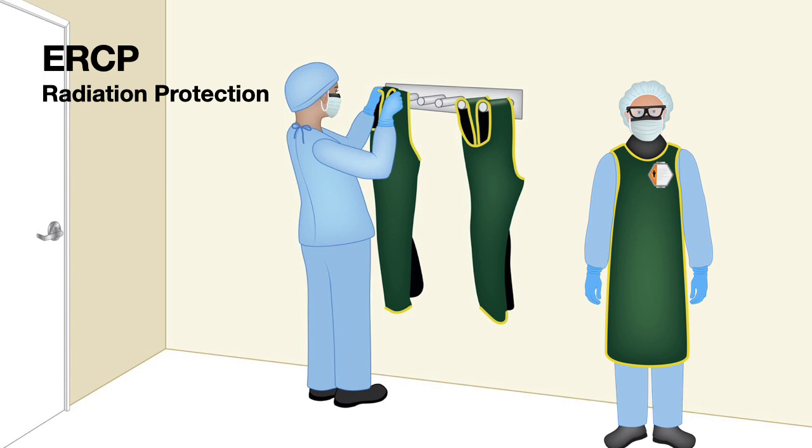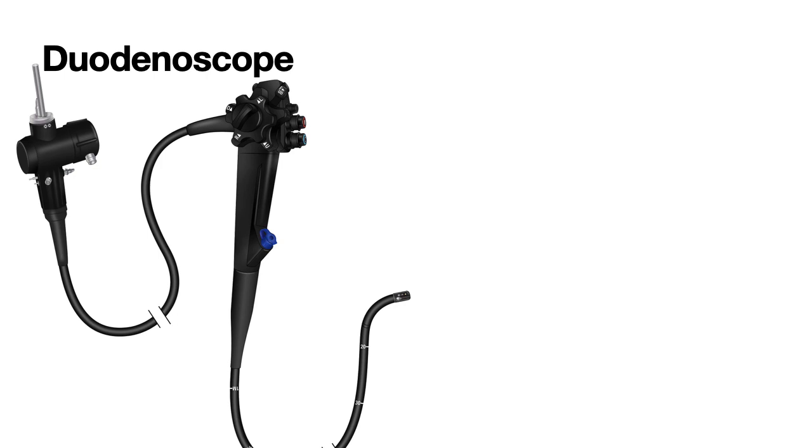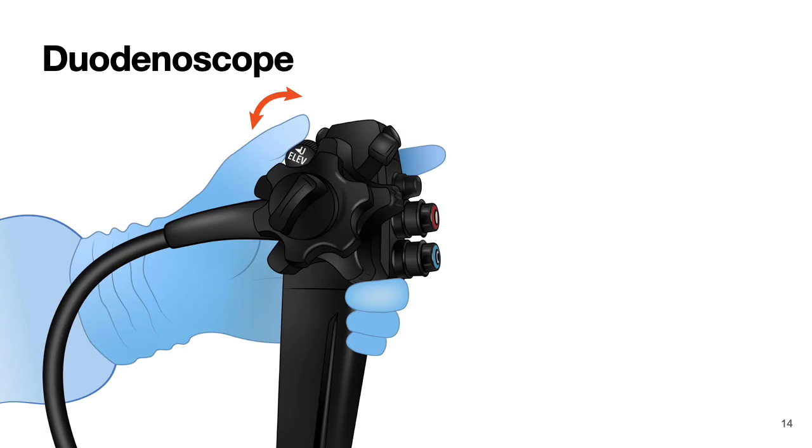When you go to the endoscopy room, you bring the duodenoscope. And the duodenoscope is like any other scope, but with two differences. One, it is side viewing, and number two, it has an elevator that can move the instrument, either a catheter or a balloon or a sphincterotome, up or down.